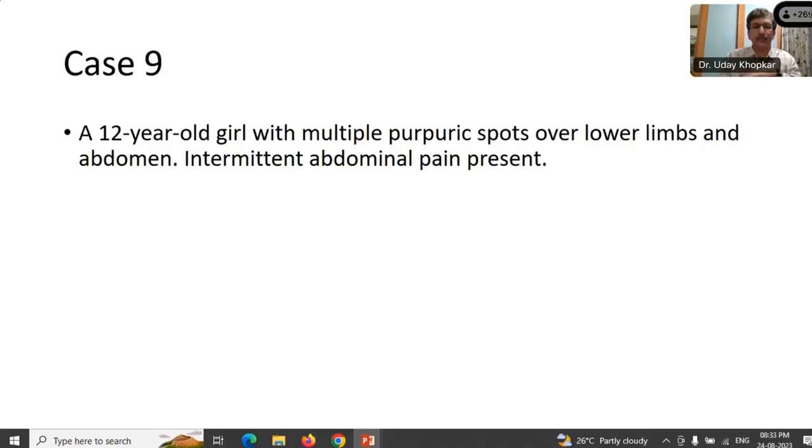It did not necessarily come as an annular lesion, maybe just papular, but usually it is bilaterally symmetric. Yes, thank you, very correctly said. Sometimes it looks like small raised bumps only, and the cause is unknown. Sometimes this could be secondary to some other primary cause.